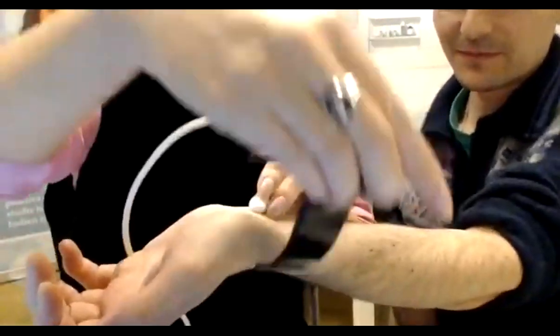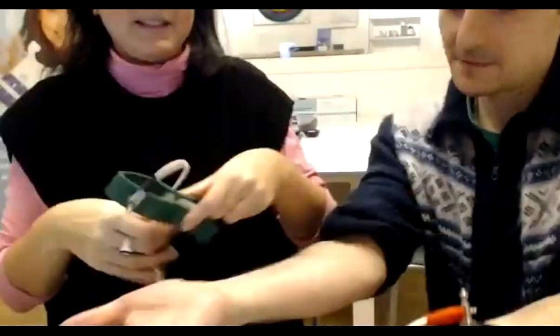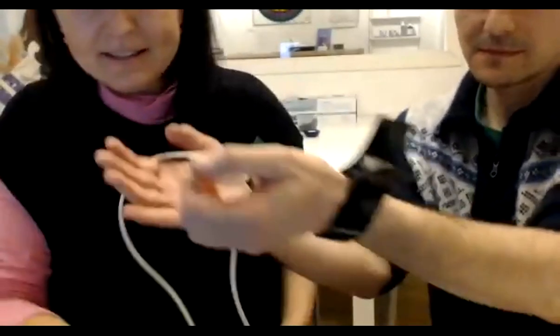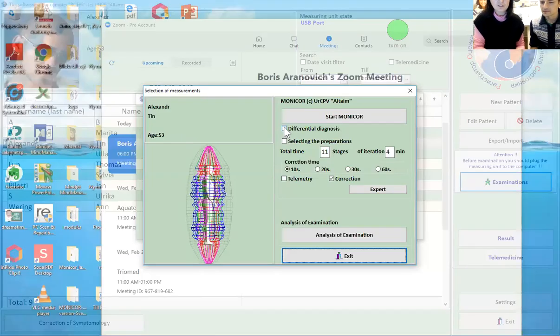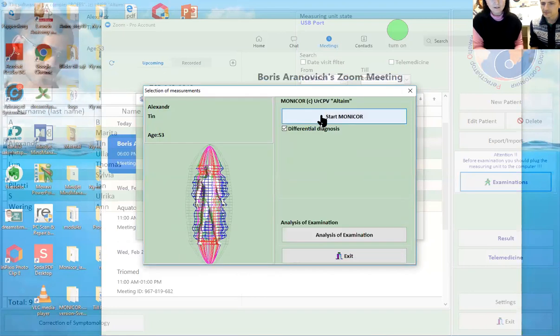So as usual, the red color to the left, on the MC7 point, and the black one to the right. Yes, and just start. Well, now I have to make it smaller again, otherwise I cannot see. This one. It wasn't there. So now we'll do the examinations, and we press on differential diagnosis, so you can see that we do the measurement, and press OK, and start.